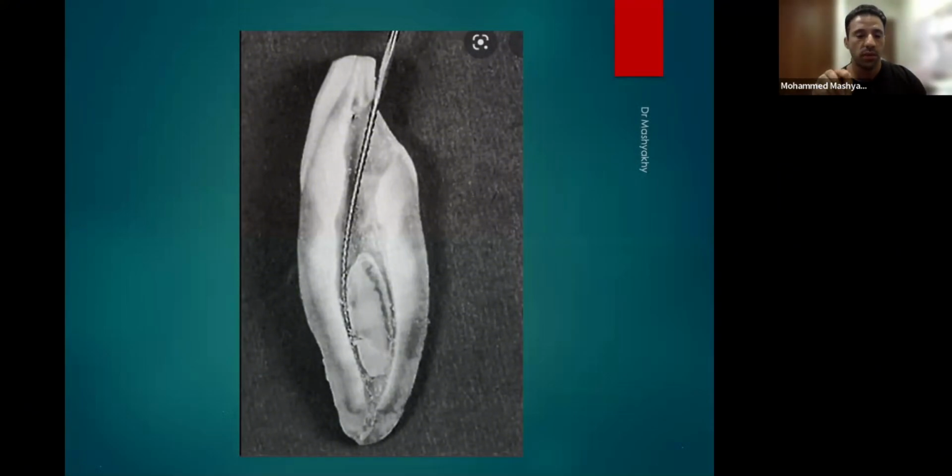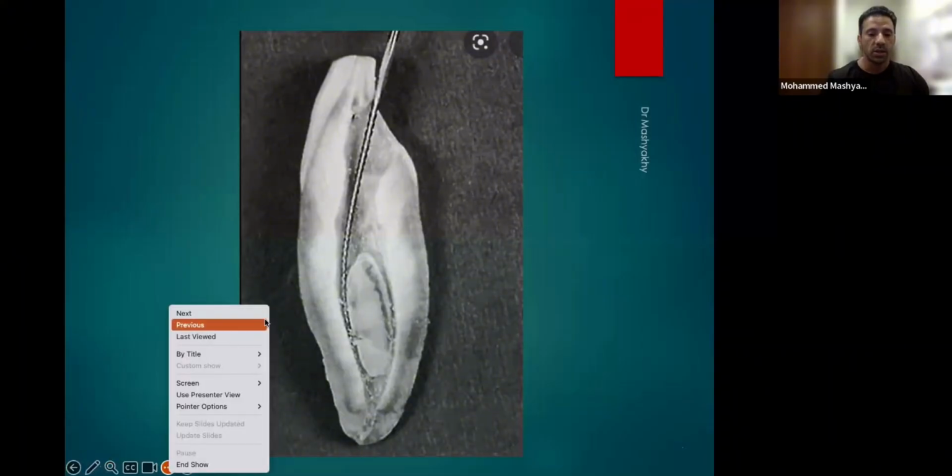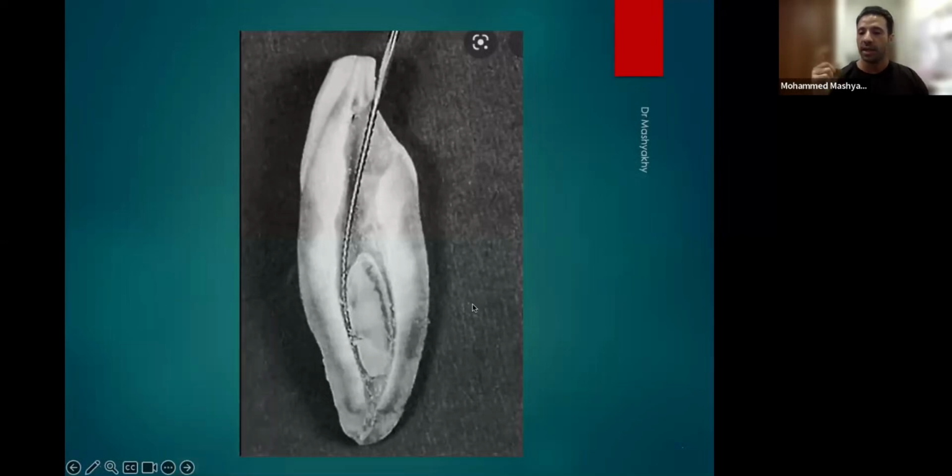Open the tooth. If you find the buccal canal in the lower central incisor, clean it, shape it to the master apical file, for example 30/04, 30/06, whatever you like. Then after you clean it, you take the small round bur and dig a little bit in the lingual side, okay? So when you go in the lingual side, you can remove this shoulder in the lingual. Take a small hand file, do the pre-curve and try to go to the lingual side. If you have a catch, there is another canal, so you have to open more and more.